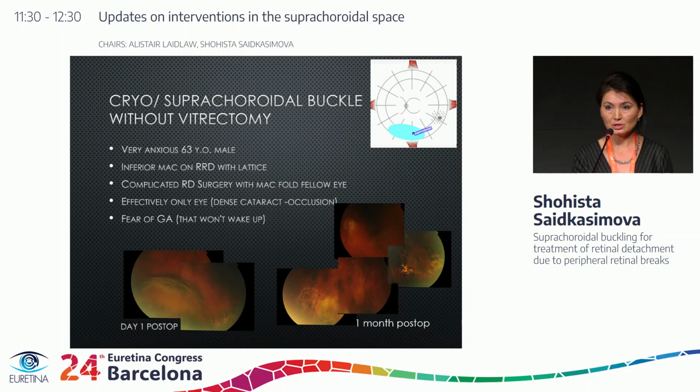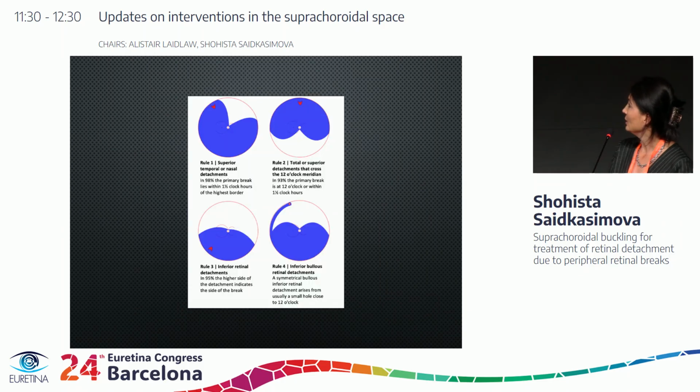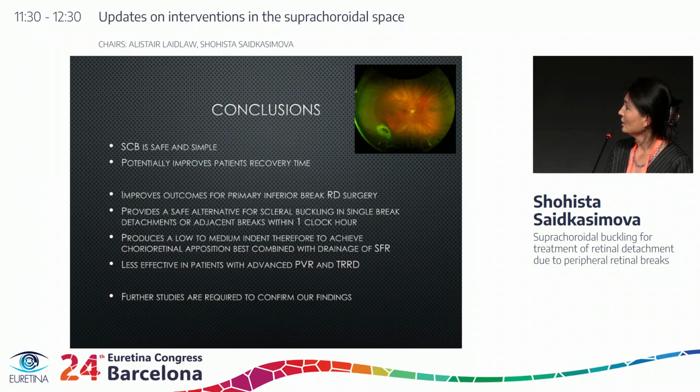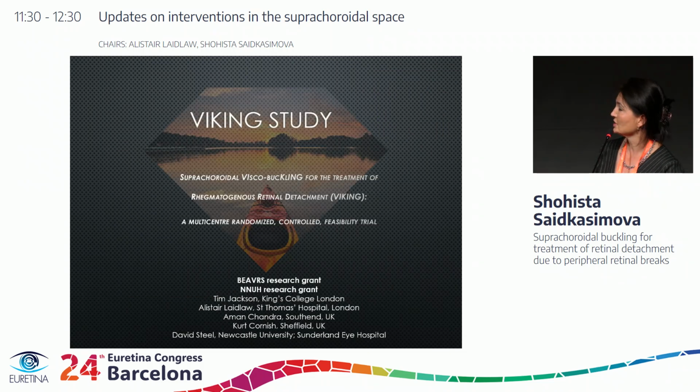In the interest of time, I will conclude my talk and just show that this procedure is safe if done carefully and improves the outcomes for detachments with inferior breaks, and also can be used as a standalone procedure instead of scleral buckling. Certainly further studies are required, and we're currently running a Viking study which we'll be able to share the results of with you hopefully in the next year. Thank you very much.